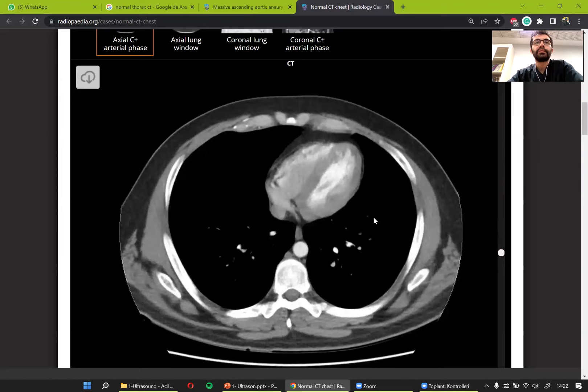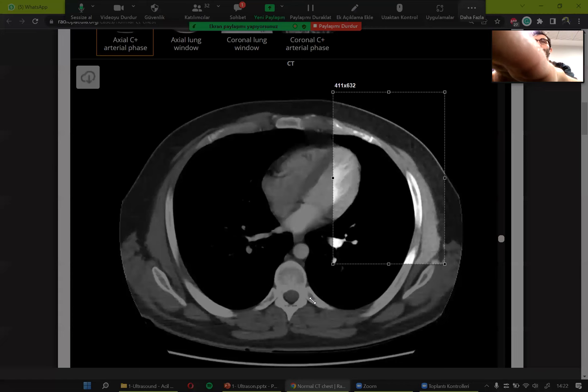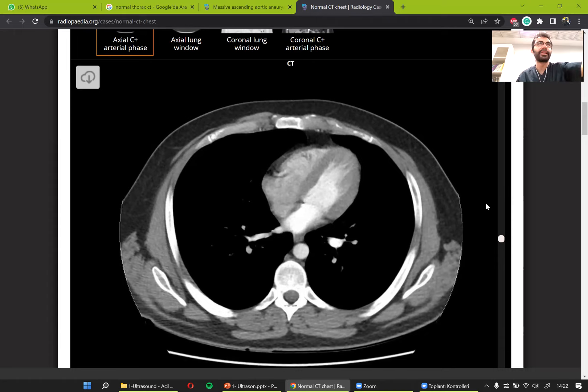We were looking at this normal CT scan with contrast. We looked at the heart and mentioned that we are looking at the patient from the bottom. So the right lung is here and the left lung is here — things get opposite in a CT scan. The same thing happens on a chest X-ray as well. When you are seeing a chest X-ray, you are looking at the patient from the front, so the things get opposite.